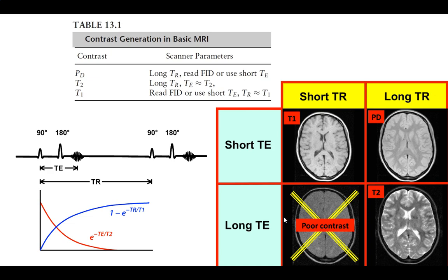But if you think for a second, T1 weighting basically comes from the fact that we get really highly excited on the T1, we let the T2 stuff wait out, and then we give it a kick. Whatever's on T1, the Z direction, now comes down onto your XZ or XY plane.